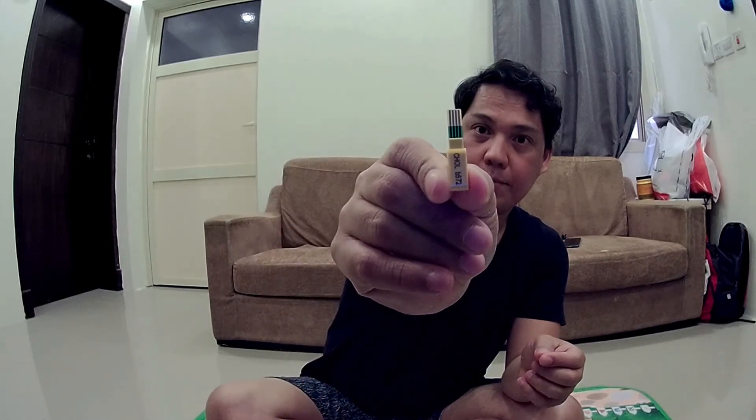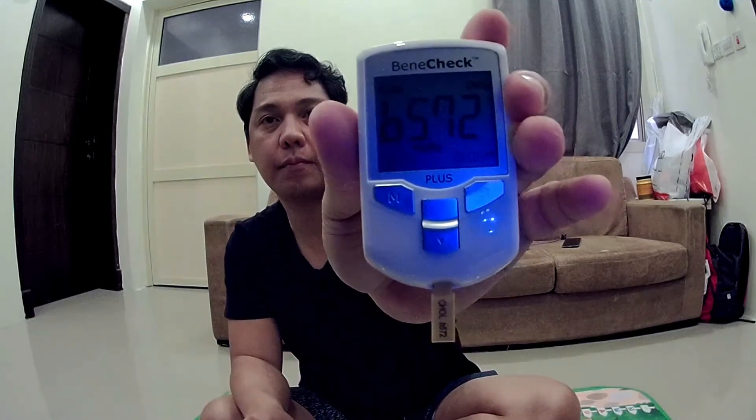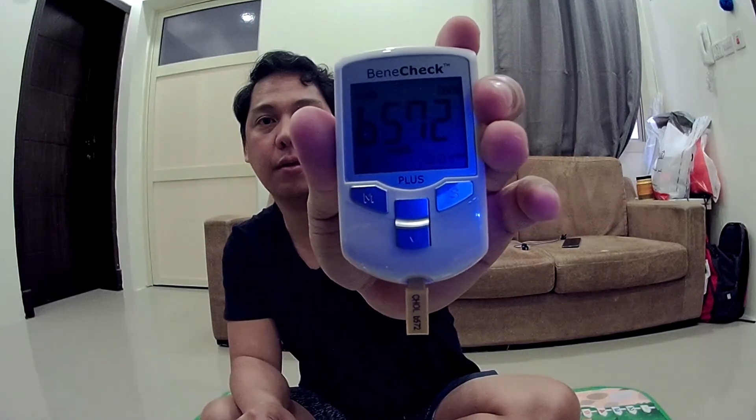Total cholesterol strip — you have the code strip, let's test it out. It reads here CHOL, code 6572. I'm going to put it in. Alright, that's the result.